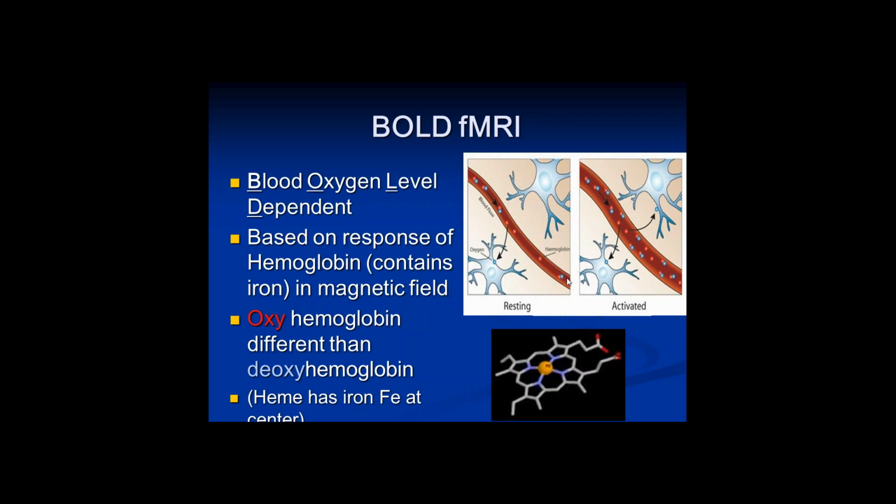Now, this brain scan using MRI is not going to be able to pick up the red-blue differences, but it's very clever. It's based on the response of tissues in the magnetic field, and so it is able to draw on the very small differences between the iron in the middle of the heme that carries oxygen in the red blood, and that's slightly different once it gives up its oxygen. So the oxyhemoglobin I showed here in red responds differently in the magnet to the deoxyhemoglobin, which I've labeled here in blue. The way you can remember that is that the heme, at the center of the blood cell, has an iron in the middle, like an iron filing, that responds in the magnet. So its immediate environment, whether or not it's carrying oxygen, makes a difference.